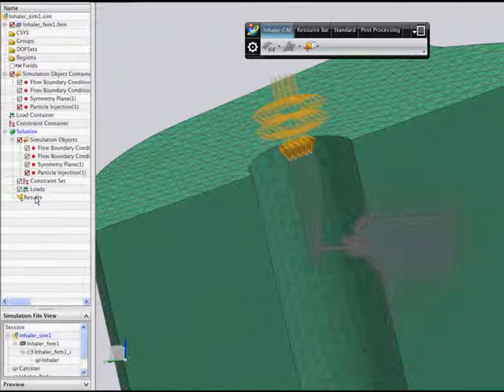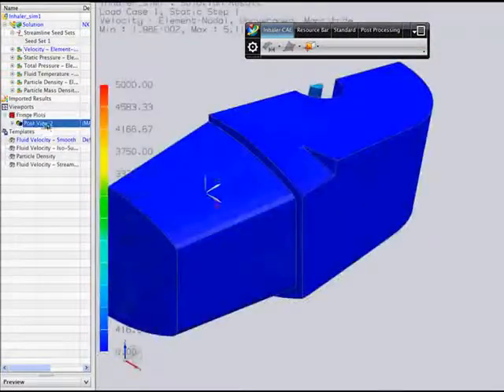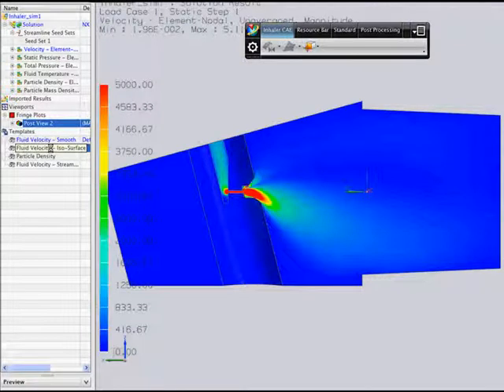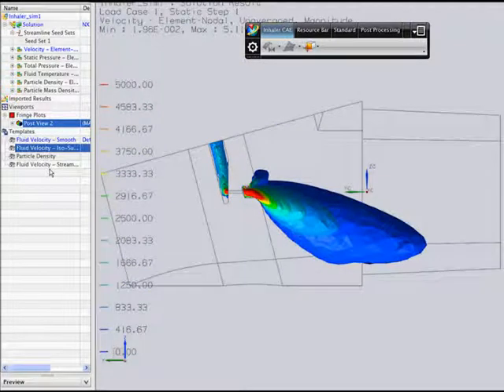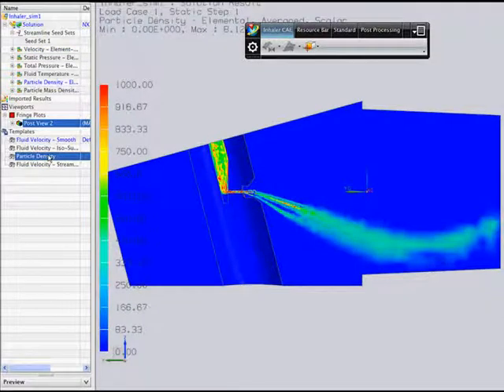NX delivers multiple out-of-the-box tools to efficiently examine your simulation results. First, review the velocity results set. This first contour plot shows that the gas jet is deflected downwards by the geometry of the discharge region. Other ways to view results include isosurface, or use streamlines to visualize the flow field. Finally, you can review the particle injection results to determine if the right amount of medication is being delivered to the patient.